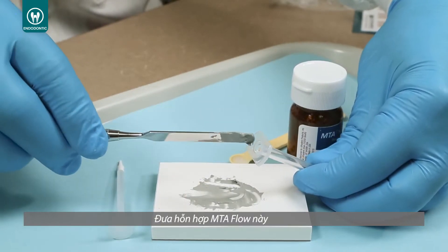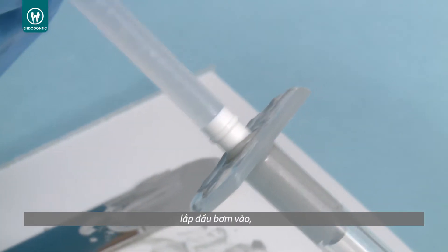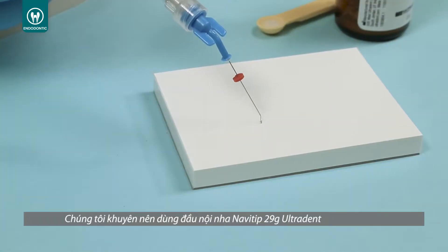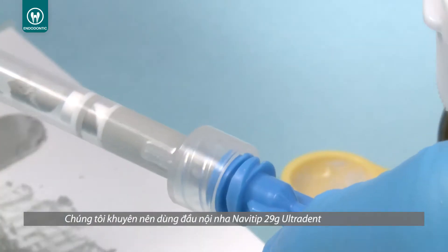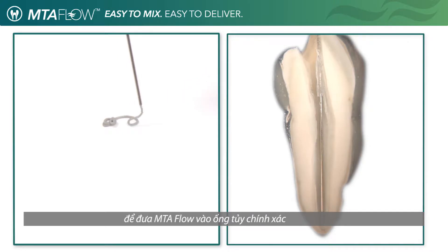Insert the mixed MTA Flow into the back of the skinny syringe, reinsert the plunger, and choose the desired tip needed. We suggest the use of the Ultradent NaviTip 29 gauge tip to accurately deliver the MTA Flow inside the canal.